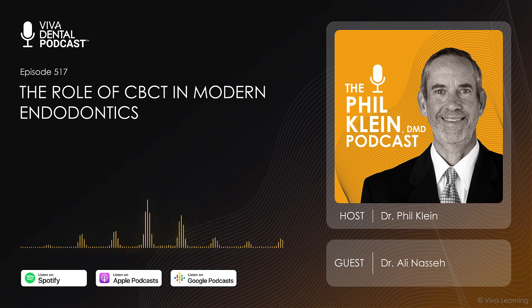So I feel that endo is now at a juncture, just like implant therapy was a while ago, where we're going to spend quite a bit of time ahead of time absorbing the information out of the CT image, building and improving that mind's image of the space we're going to be working in before we go inside the tooth, so that it's all planning and then execution, as opposed to before, where it was execution, evaluation, exploration, rebuilding that image, and then execution. So we get rid of all of that and go straight to the point.